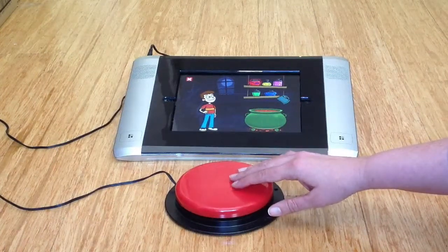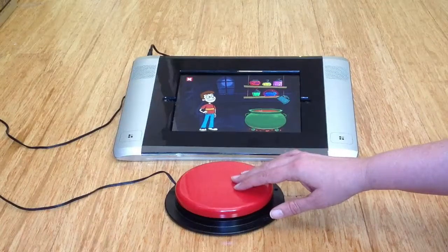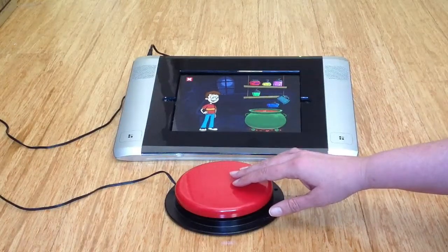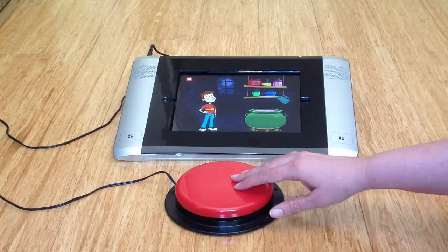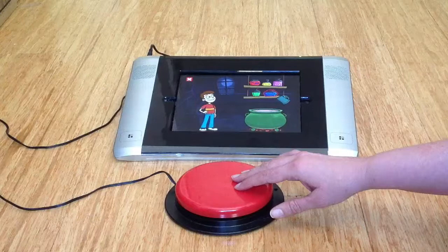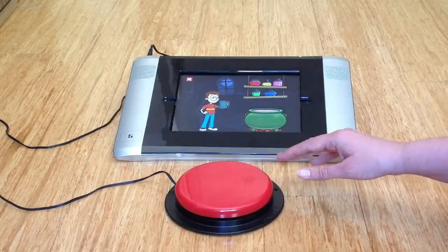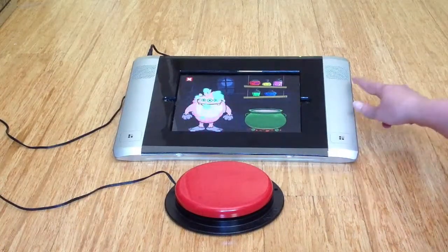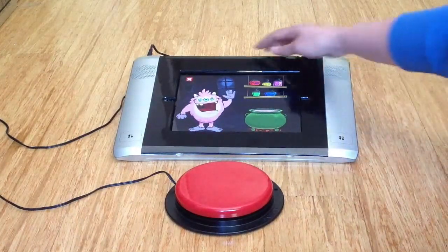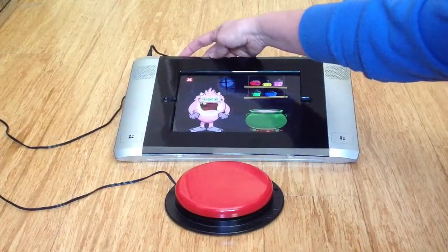So in one switch mode, it's automatically scanning in this app. And then once we choose our item, we're going to get a little bit of music playing in a moment. So I might want to adjust the settings for volume, which can be done on the Connect case. You can see the speakers, and the volume can be controlled at the top here.